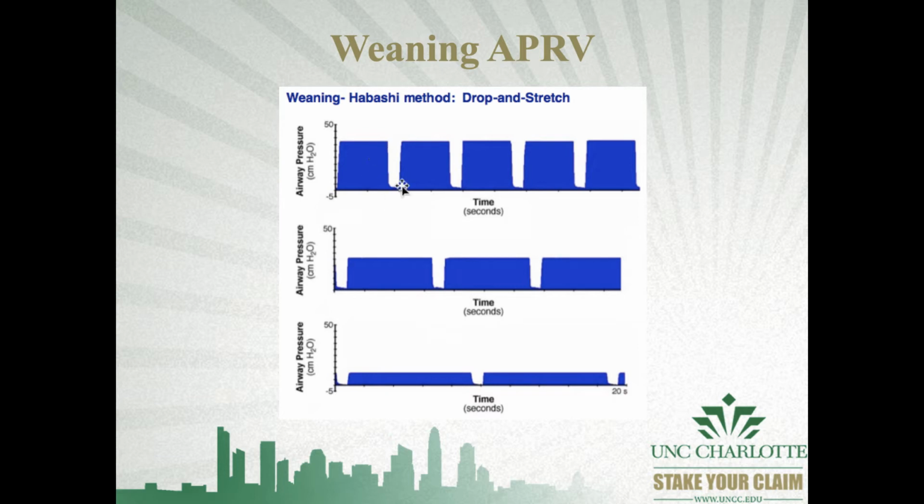Also, when we have this release here, you've got to think about it. This patient's breathing. We have this release here that's almost a forced expiration. Let's say we have a patient taking their spontaneous breath in right here, and then our machine decides to give them a release. Well, it doesn't decide, it's time cycled. So at whatever time it cycles, it gives a release. This patient's taking a breath in, you're taking their breath away immediately right there and dropping that complete flow, causing asynchrony and work of breathing issues. Often patients aren't always comfortable breathing like this.